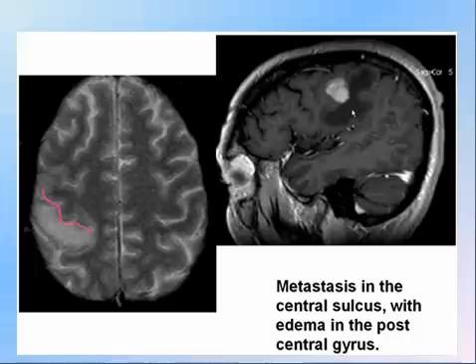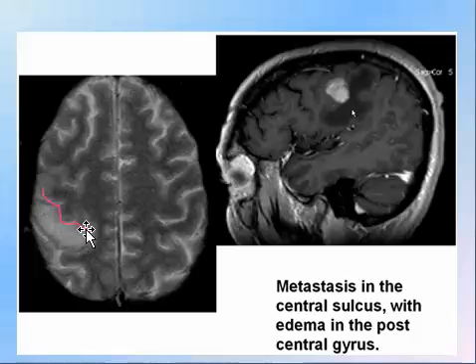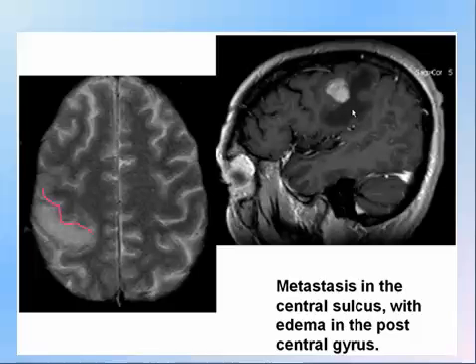Recalling the central sulcus, post-central gyrus, and precentral gyrus: the lesion here is posterior to the central sulcus, at the post-central gyrus. There is edema and a tumor visible. The deposit is seen posterior to the sulcus in the region of the post-central gyrus.